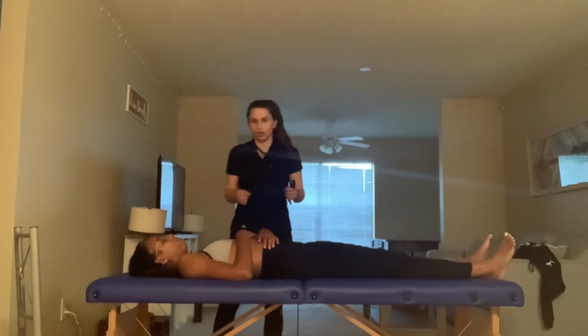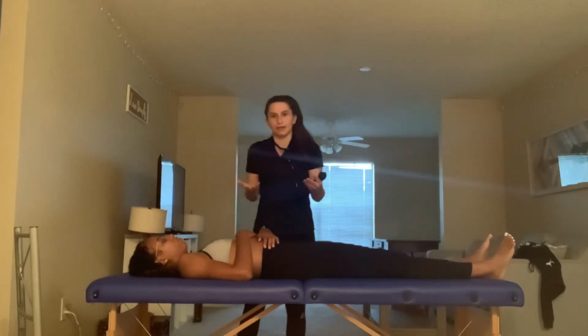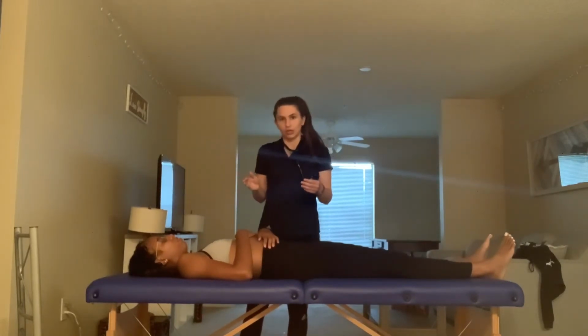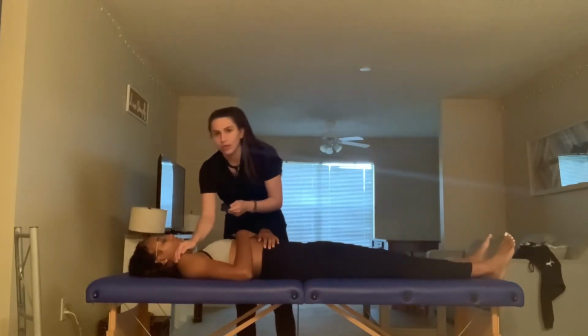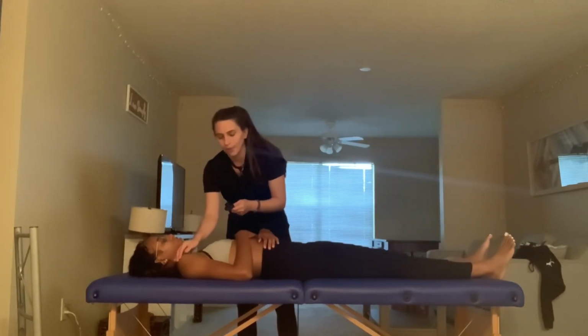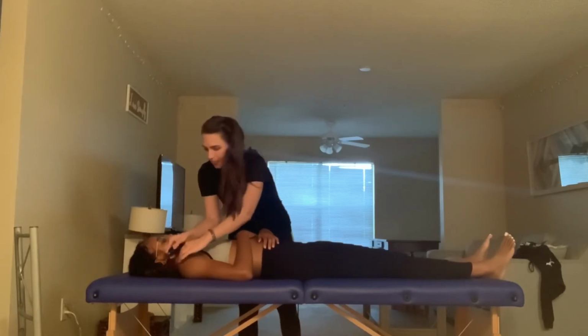If you are more confident your fracture is located in the proximal humerus, the stethoscope can be transferred to the flat part of the acromion and then again percuss on the distal olecranon. In order to do this, ensure both the patient's acromions are flat enough in order to properly place the stethoscope and assess for a potential fracture.